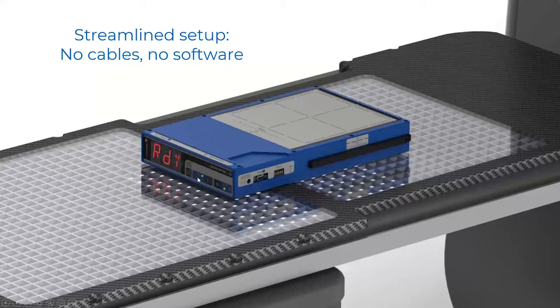On the front face of my device, there's a button here that says photon or electron, and you pick the mode. You know that you're on the photon side because the light indicates photon, and the display is upright, is correct. It says RDY, ready, I'm all set to go. When you would flip this over for the electron side, you'd press that mode button again, and the display would invert again, so if your display is upright, you know that you're on the correct side. And of course, it does say photon or electron side right on the device. So it's easy and you don't get confused.